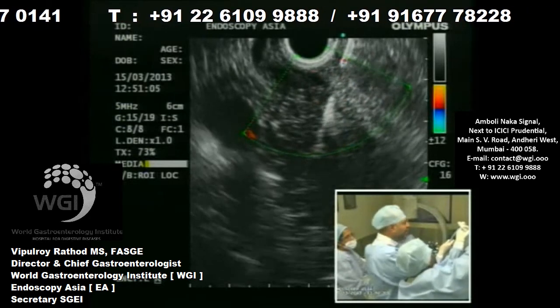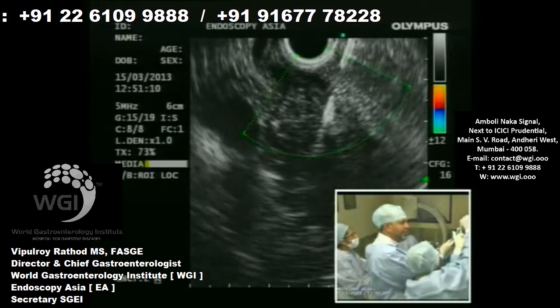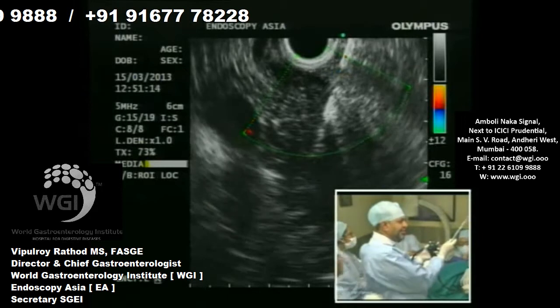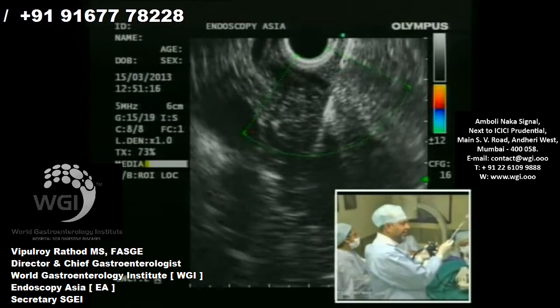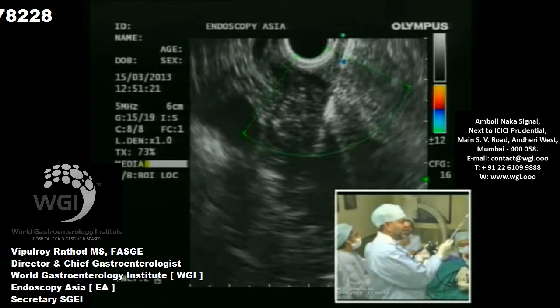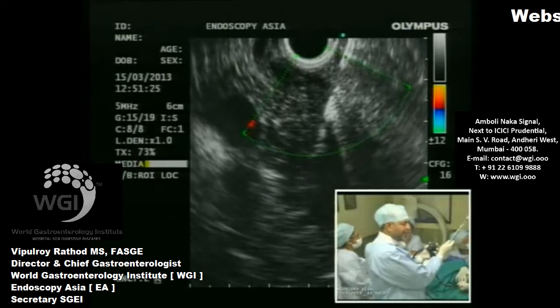And I don't see any abnormal vascular blush, which tells me that we are absolutely safe in terms of FNA, even though there are some vessels in that area. So endoscopic ultrasound guided FNA with color Doppler has revolutionized the way you approach pancreas.